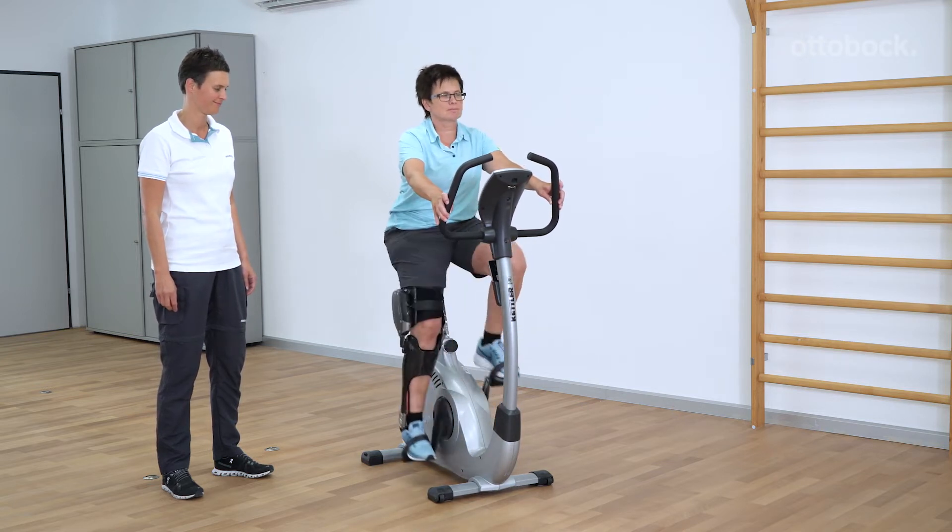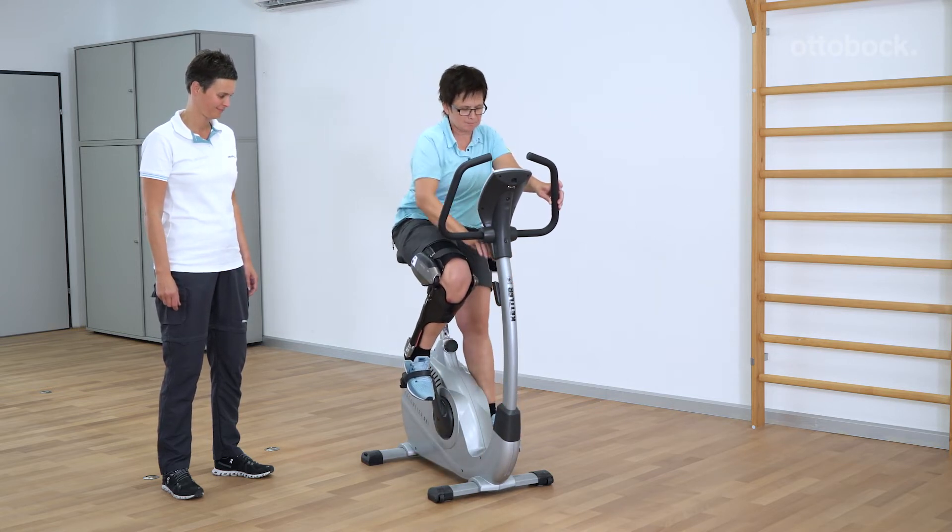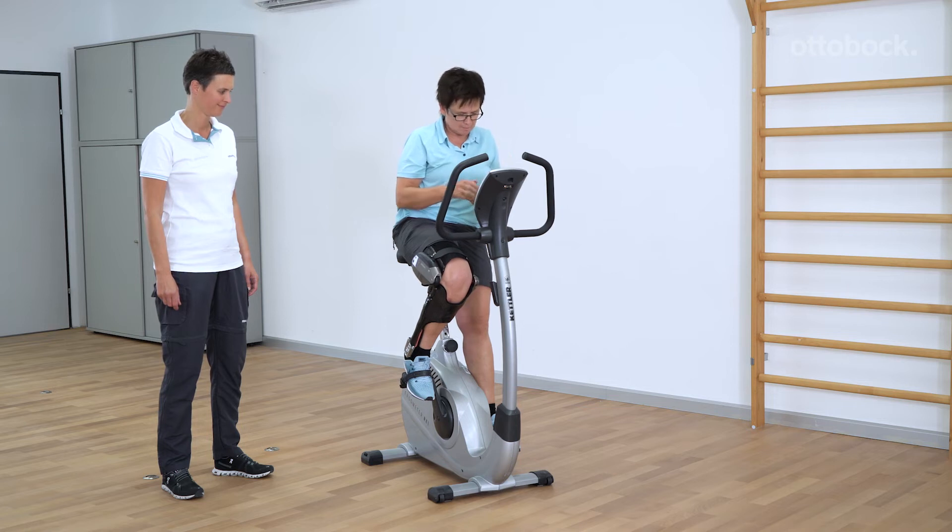In this case, the My Mode was configured for cycling. Familiarize the patient with the My Modes in the course of the training.